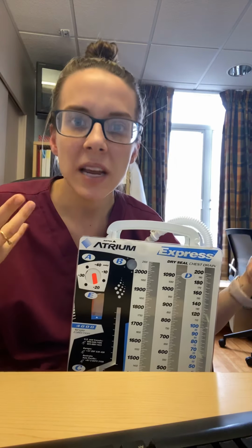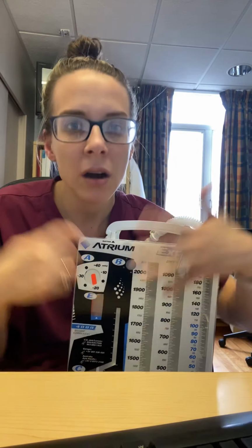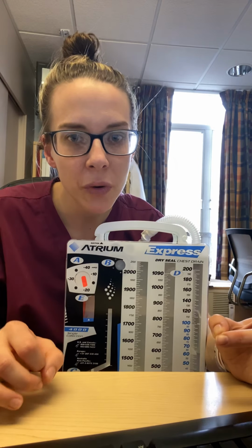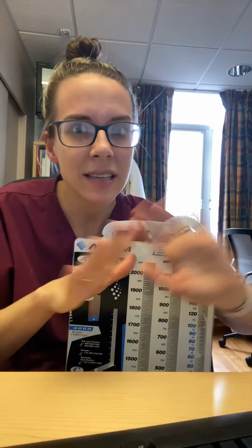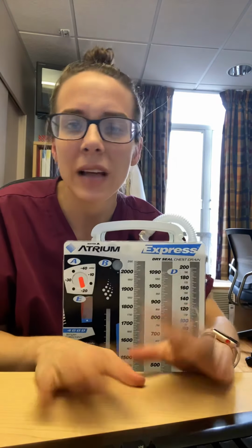Obviously, if your tube isn't tidaling, the patient's getting more short of breath, and the pneumothorax is getting bigger, then you have to be concerned. I think there was one patient ever where we had to get something called a Fogarty catheter, some type of vascular catheter, and the surgeon had to disconnect the whole circuit at the bedside and rotor-rooter the chest tube. It was crazy. That doesn't commonly happen.